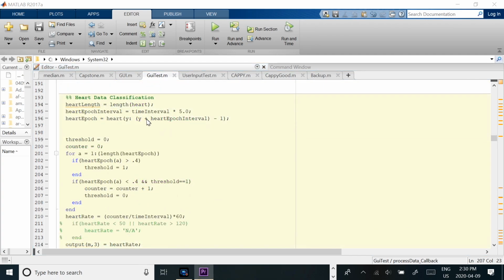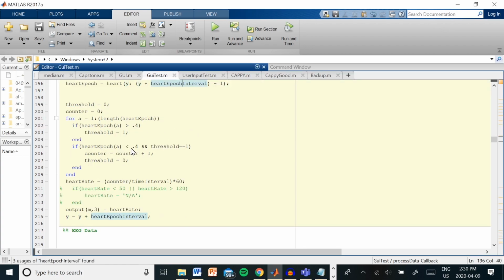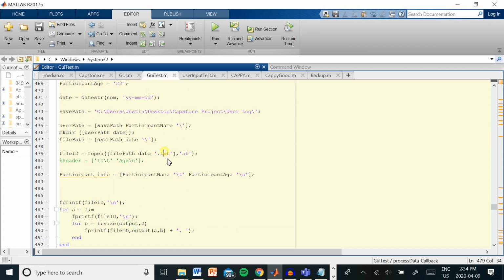The heart rate section scans through the data for each epoch, and every time the received value transitions past our threshold value, the heartbeat counter iterates by 1. Once we get to the end of the epoch, we divide it by the time interval and multiply by 60 to get beats per minute. Finally, the program exports all of the points of interest to a text file under today's date in the user's log.